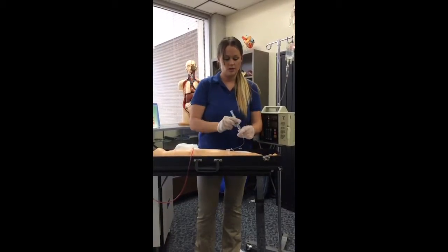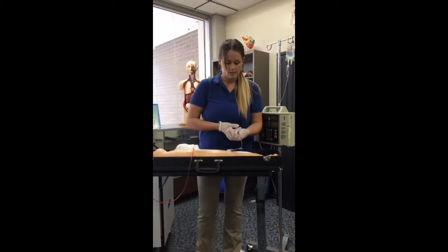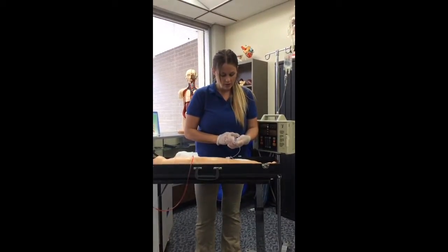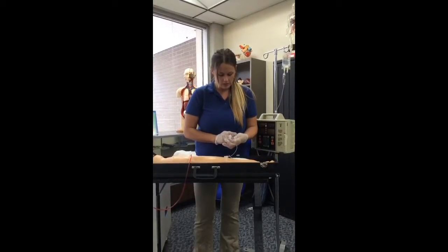Now I'm going to do a SASH method. I'm going to aspirate. I see blood return. I'm going to push only 3 ml of the saline.